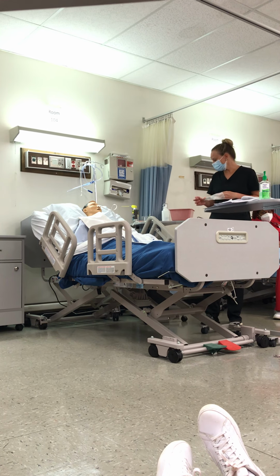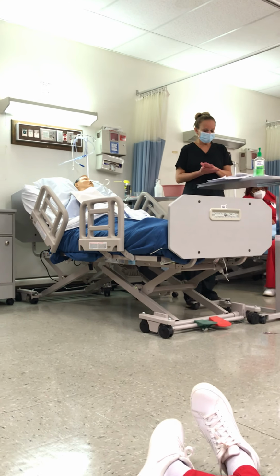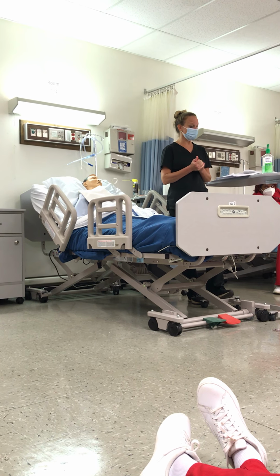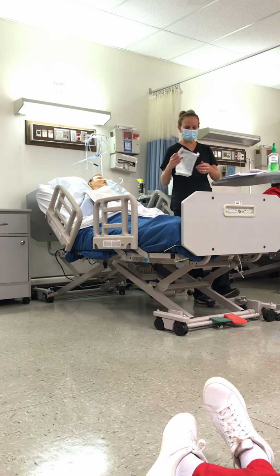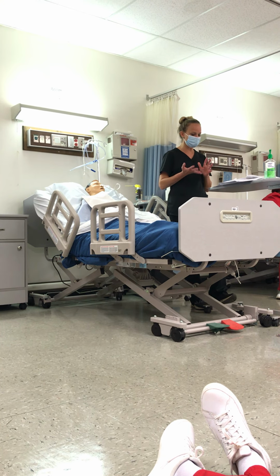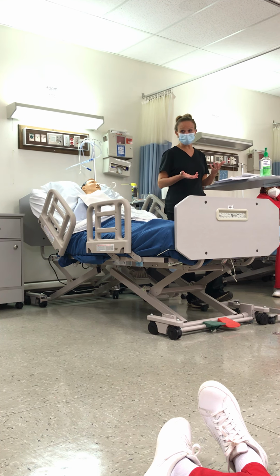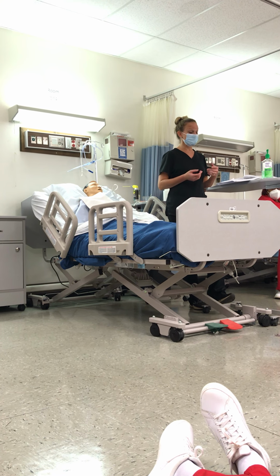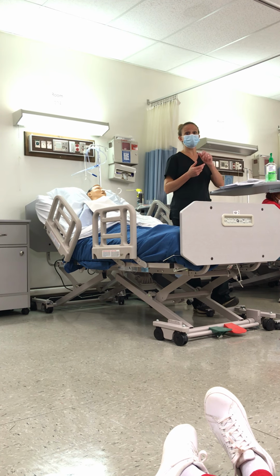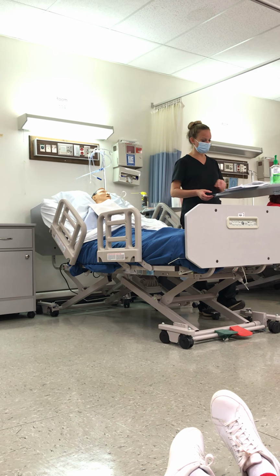In here it shows you sample documentation of tube placement. Y'all need to know how to do that, okay? So y'all need to read through this. What French was this one? It's a 16, so we want to put that, and on these tubes, you know that you lubricated it, inserted without difficulty, right or left naris. If you had difficulty, what would you put? Then what else would you put right behind it? How you rectified that problem, right? Tube was rotated, and then insertion was successful at that point.